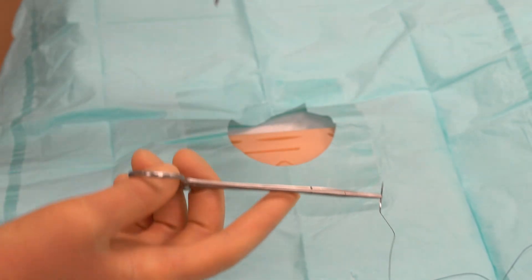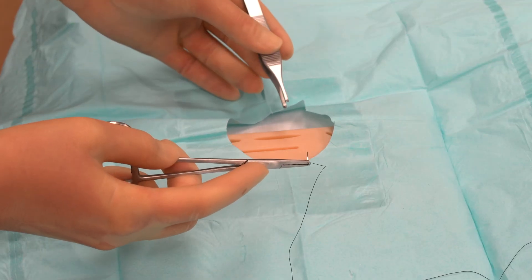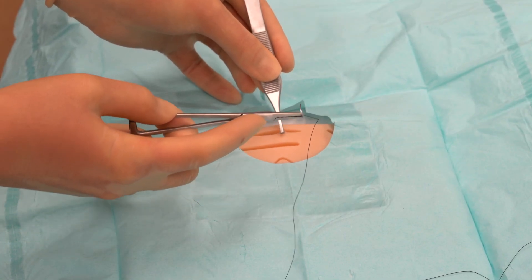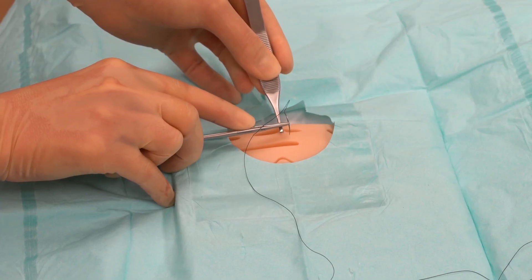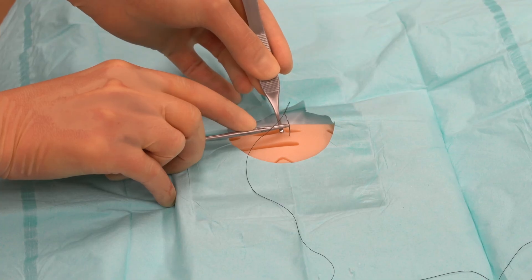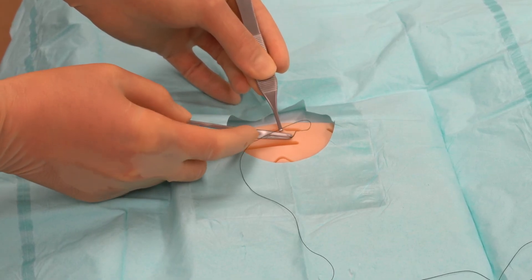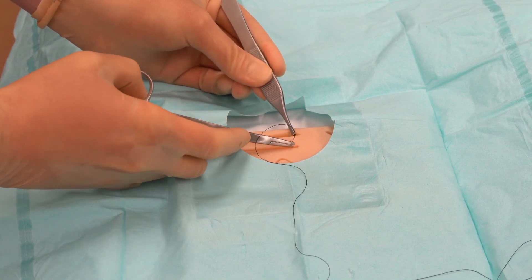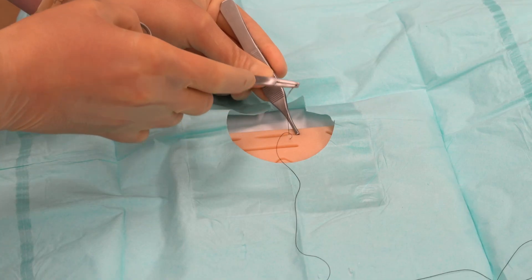With my non-dominant hand I'm going to pick up the forceps — these stabilize the skin as we place the suture. My first stitch will be placed about a centimeter away from the edge of the incision. I grasp the skin edge with the forceps, then rotate my right hand so the palm faces down, place the tip of the needle on the right side of the wound edge, and enter the skin perpendicular to the surface. I push straight down to the floor, pierce the skin, then rotate my hand so the needle tip comes out the center of the wound. I let go with the forceps, hold the needle tip to stabilize it, push it through, then re-grab the needle with the needle driver and pull it the rest of the way through.